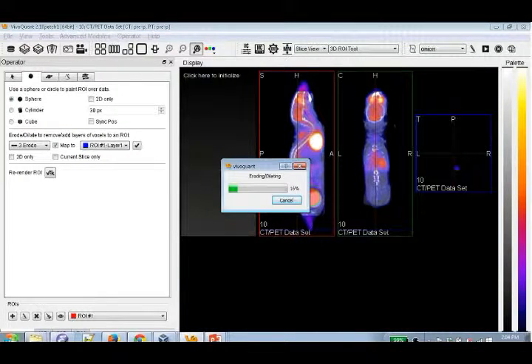And so here I would have been pressing all the buttons myself, but now I can go take a walk and come back. And I'm always feeling like I'm working if the computer is processing things. Like my code's compiling.